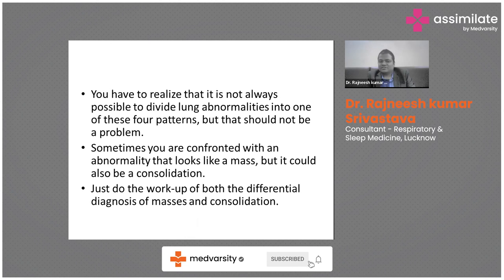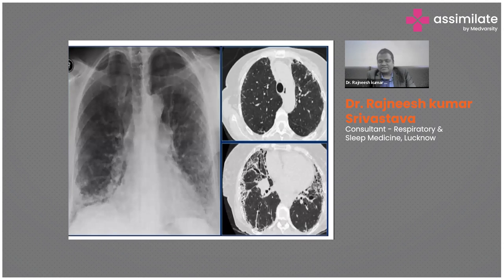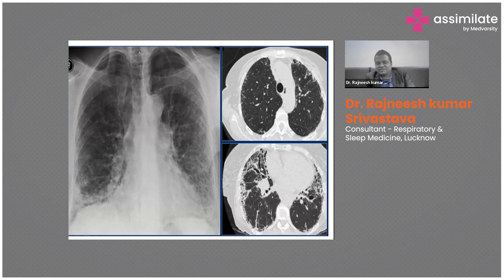Returning to the X-ray showing reticular shadows — when CT was performed on this patient, a characteristic ILD pattern was identified. We must acquaint ourselves with CT patterns of interstitial lung diseases. On CT we can see septal thickening, and there is also bronchiectasis visible. The bronchiectasis seen in ILD is known as traction bronchiectasis because it is secondary to fibrosis, not the same as that seen in cystic fibrosis.